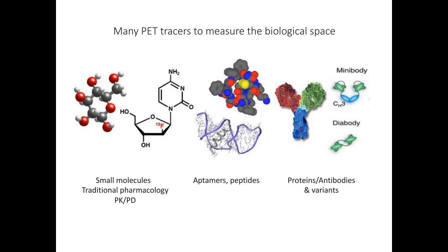So radio labeling simply means adding, in this case, what you can see on the small molecules, an F18, a fluorine-18 isotope that emits gamma rays, and by allowing us to see these gamma rays with these detectors, we're able to actually see the biodistribution of these different types of molecules. And depending on the molecules that you choose, you can see what's called functional imaging, or you can also see what's called reporter imaging, or localization of certain proteins or receptors in the body in real time.